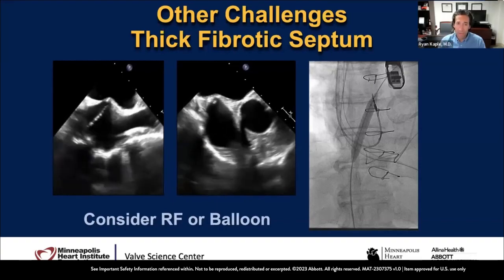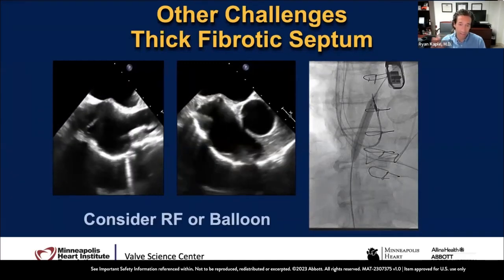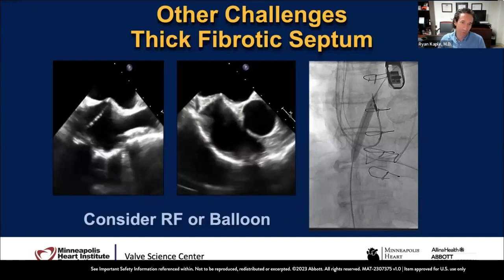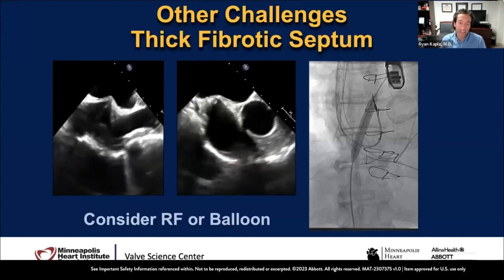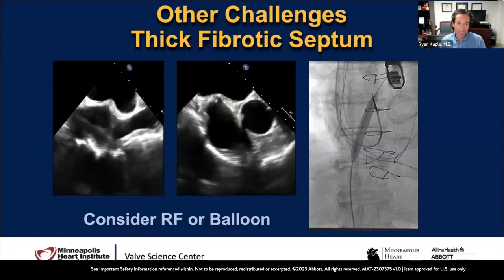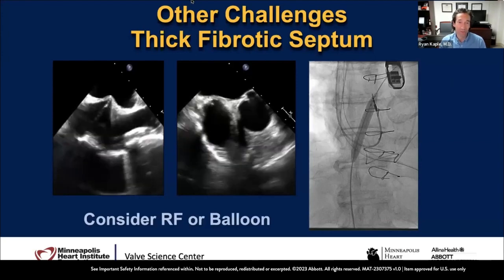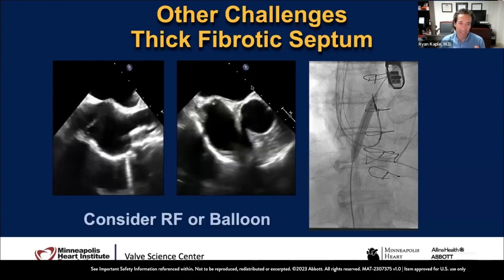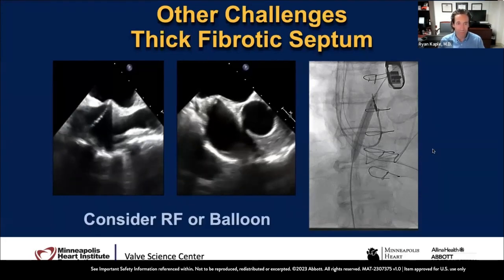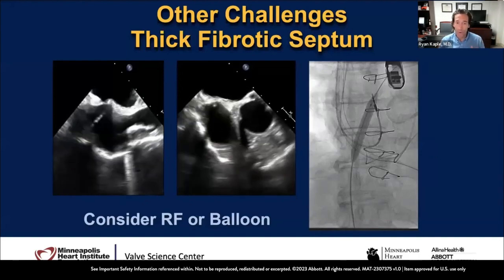Oh, absolutely. If there's any question in terms of how the dilator passes through from the right to the left side, if it doesn't pass freely, take the time to do the balloon. Because if you find out when your MitraClip guide is going up that you can't get across, then that is coming out. You have to put a dry seal sheath to seal the groin while you then go up with a balloon. So it saves that step, and you'll get that feel over the years. But if there's any question about being able to pass through, especially if it looks like this, or if it's a post-surgical septum, go ahead and do the balloon.